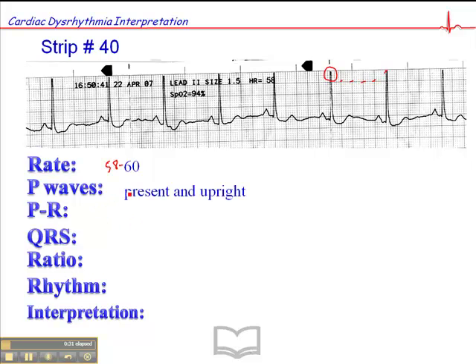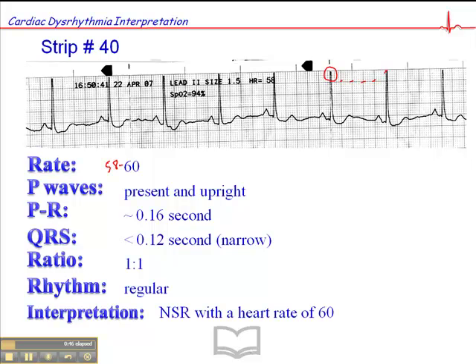The P waves are present and upright. The PR interval is approximately 0.16 second. The QRS is narrow — less than 0.12 second. The ratio of P waves to QRS is 1 to 1. The rhythm is regular. Assuming the heart rate is 60, this is a normal sinus rhythm. It's as simple as that.